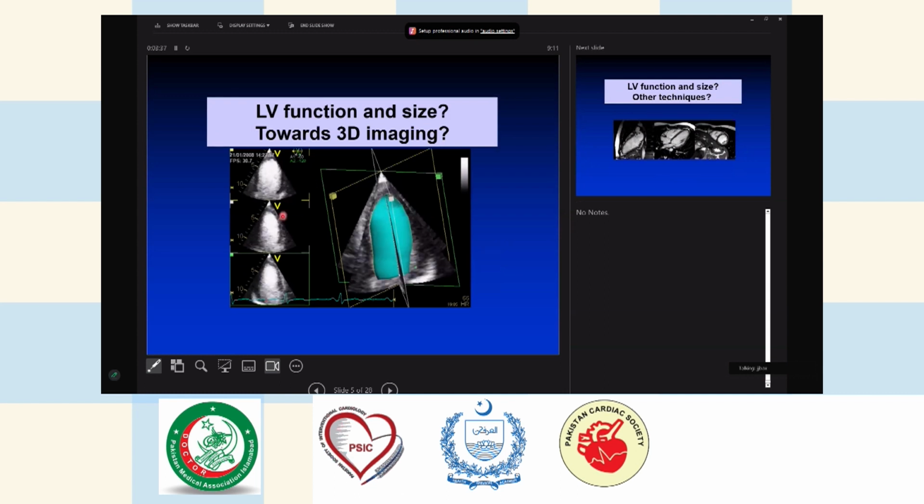We start to move away with echocardiography more and more from 2D imaging to reconstructed 3D imaging. And now most of the systems have all introduced that, and we see very, very well the LV function. And when you add here also the contrast, you get an even better picture. And it's very easy to quantify with these 3D approaches the LV ejection fraction. We have moved on now to artificial intelligence in our department, where this is all done by the modern machines automatically for you. You don't have to measure anything anymore, the machine gives it.